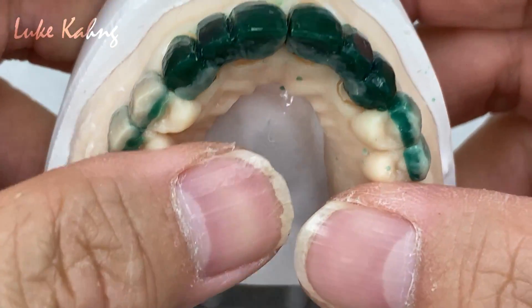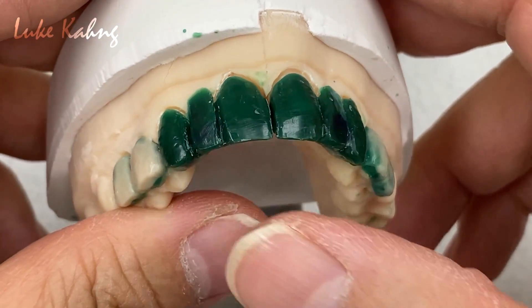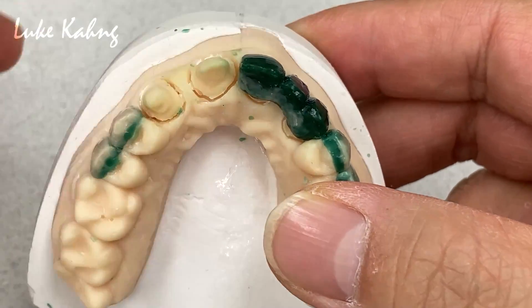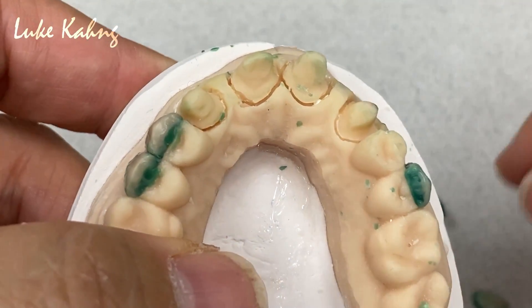The material selection regarding — this is handmade, the wax design — kind of open bite. So we would like to go to the lithium disilicate; it's better than zirconia for this case.